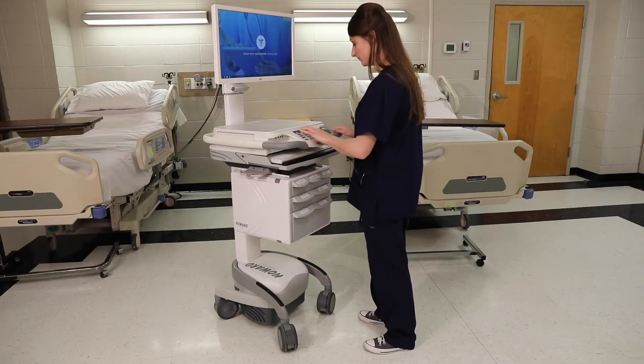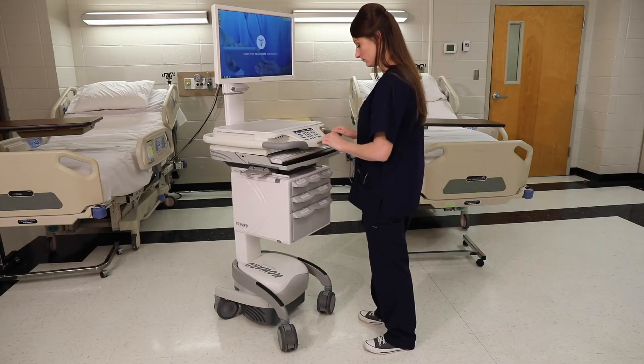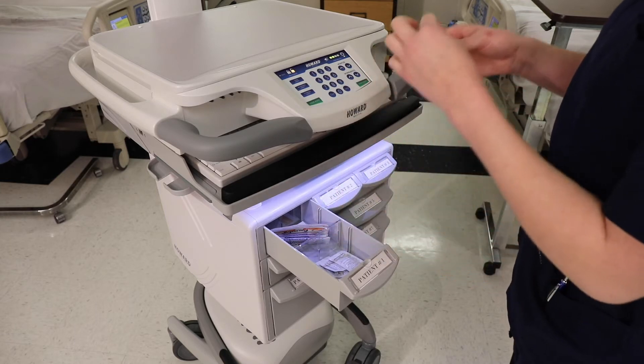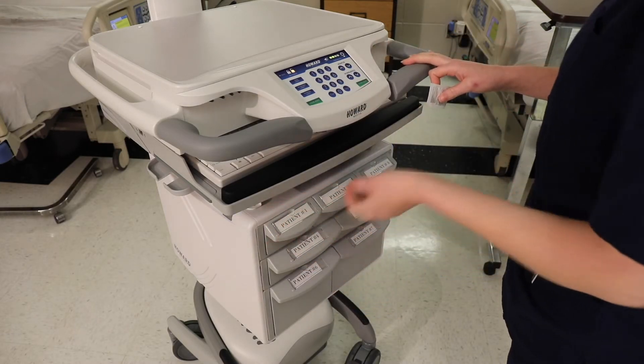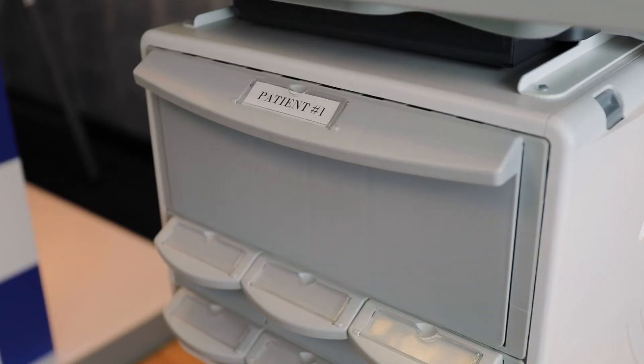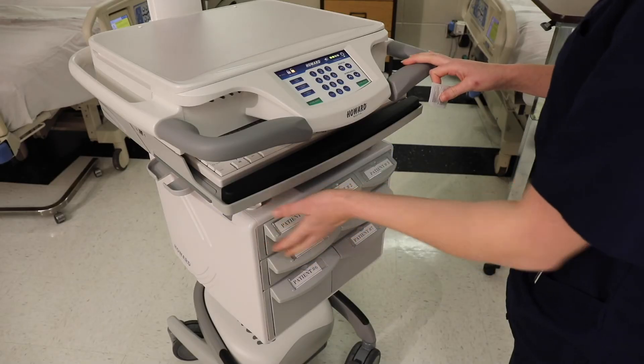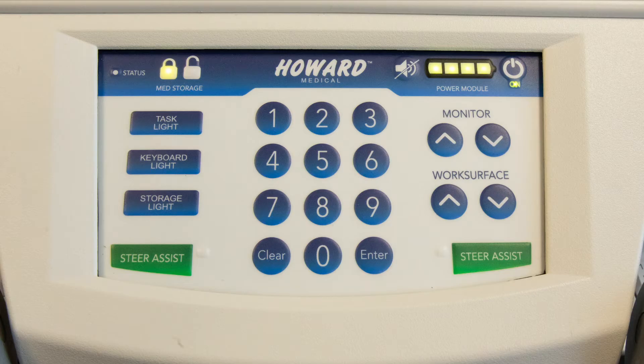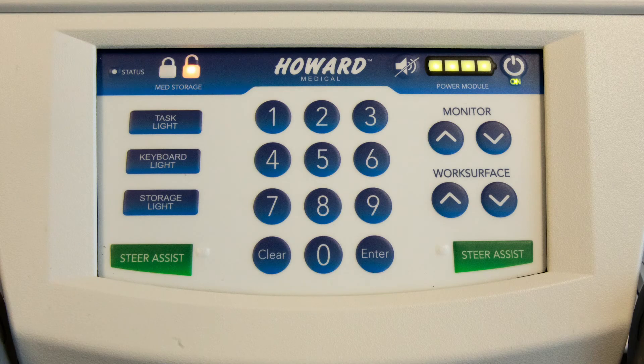Our customizable medication drawers provide secure, lockable storage for medication dispensing. A user-specific unlock code is entered into the keypad to unlock the drawers. To improve visibility, a dedicated storage light can be activated with the keypad. After medication is dispensed, the drawer can be locked manually via the keypad or by an adjustable automatic relock timer. When the drawers are locked, the corresponding keypad lock and unlock icon is illuminated.